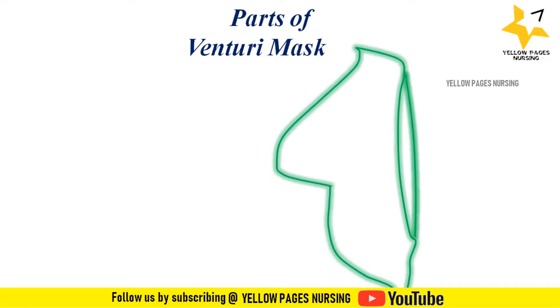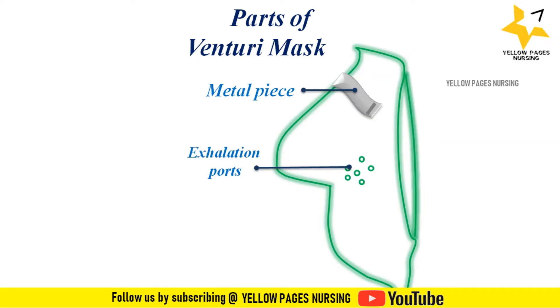Parts of Venturi masks: it consists of a face mask which sits on the face covering the mouth and nose. It has a metal piece or nasal clip which gets adjusted on the nasal bone. It has exhalation ports and an elastic strap.